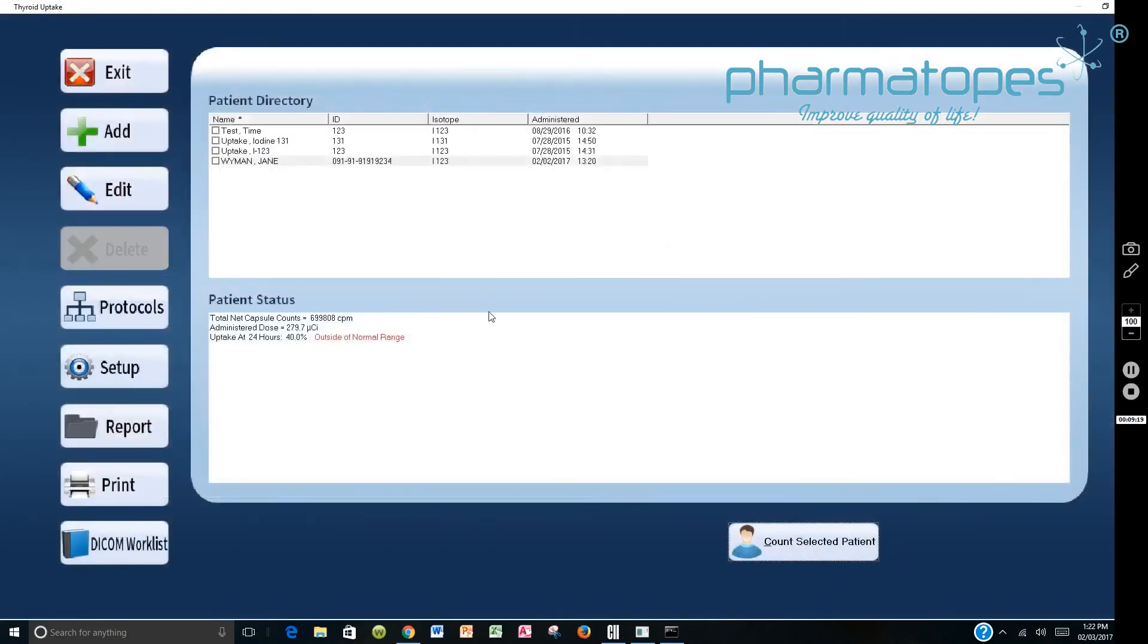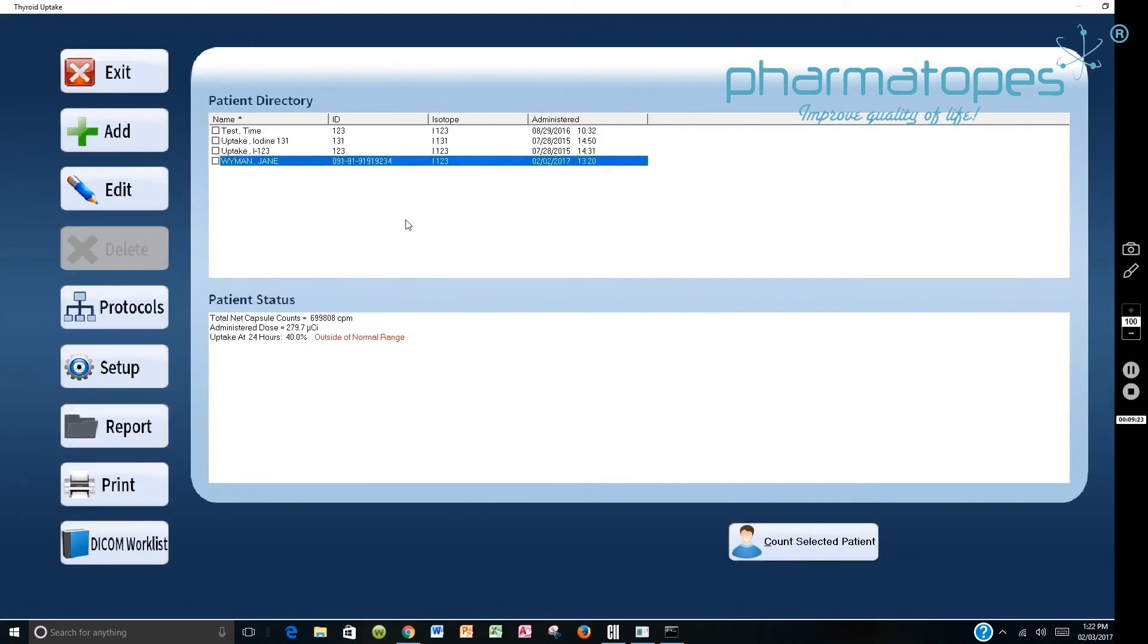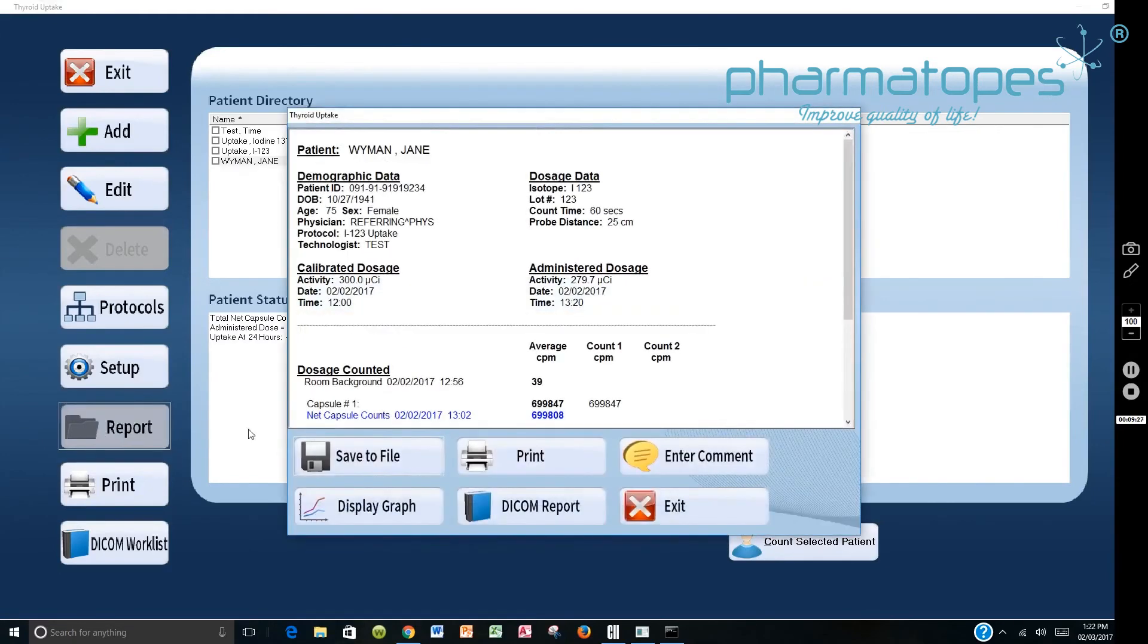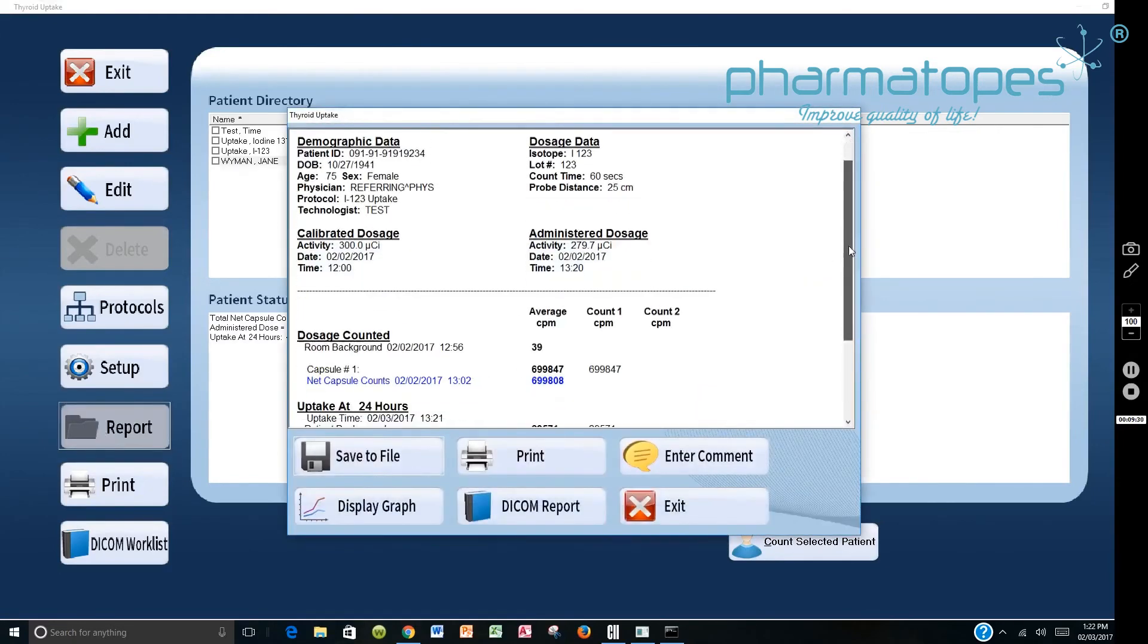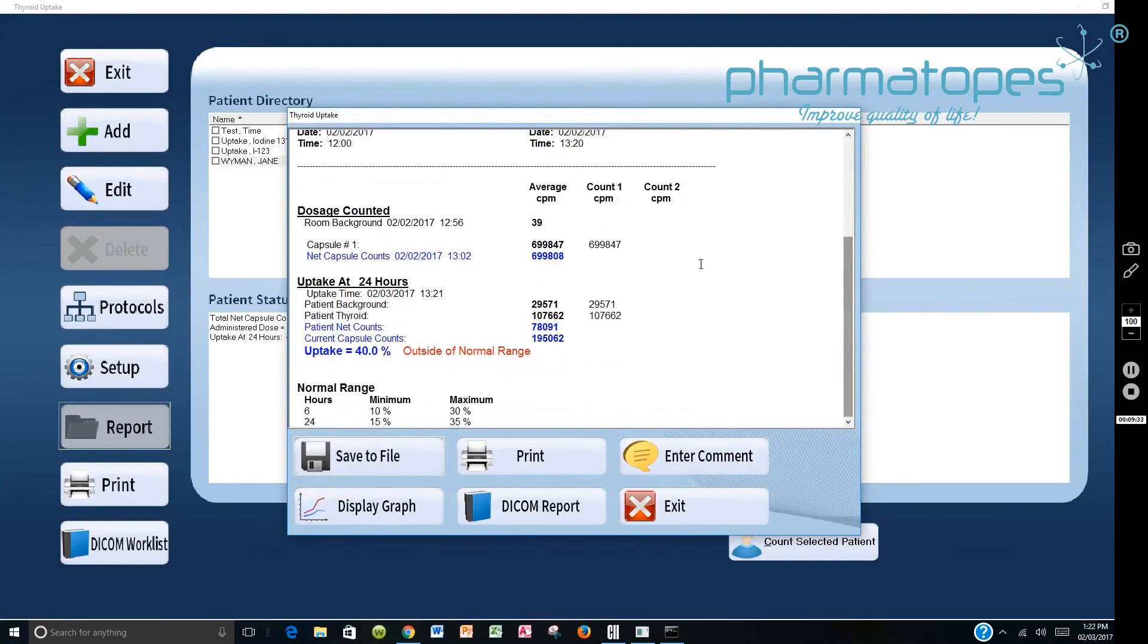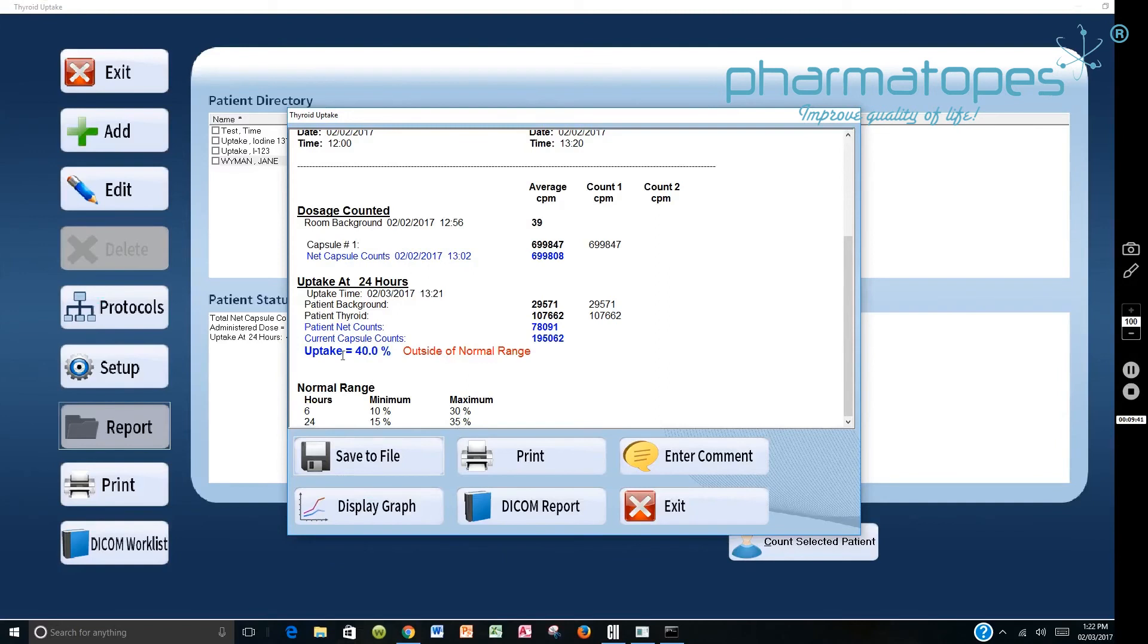Then you will be able to go down and say I want to create a report, a DICOM report. So you would say report. It brings up the information here on Ms. Wyman. It tells you what the original count was, what the count was done at 24 hours, what time it was done. And because we're looking at 15 to 35 for the normal value, the uptake is showing as 40%, it's outside of the normal value there. So we want to create a DICOM report.